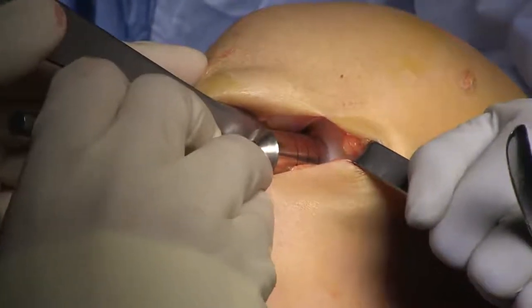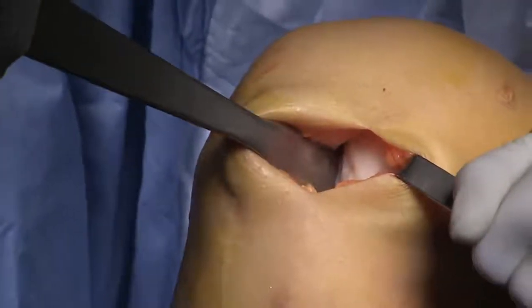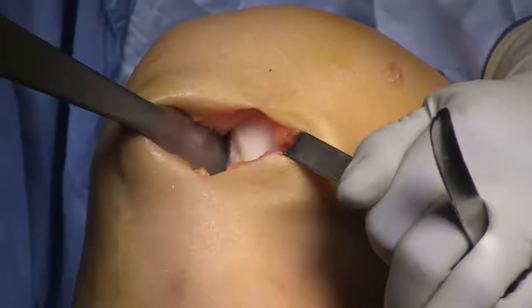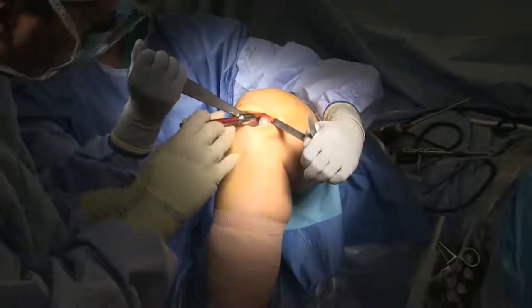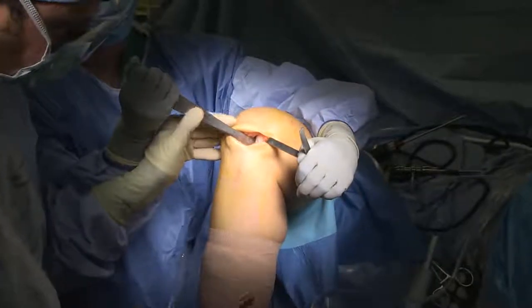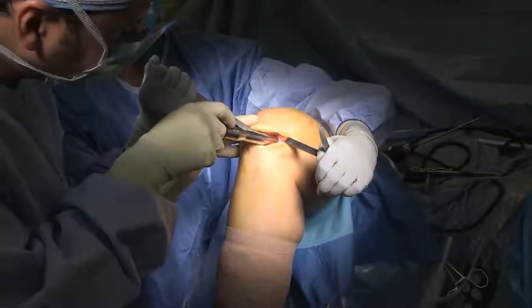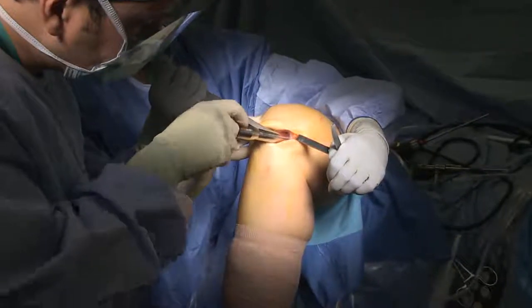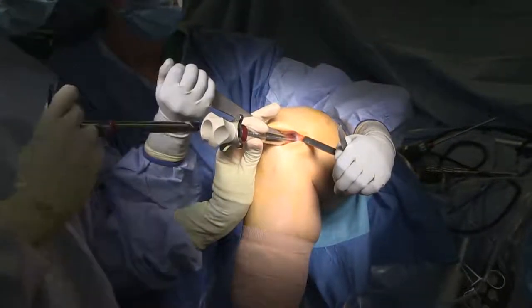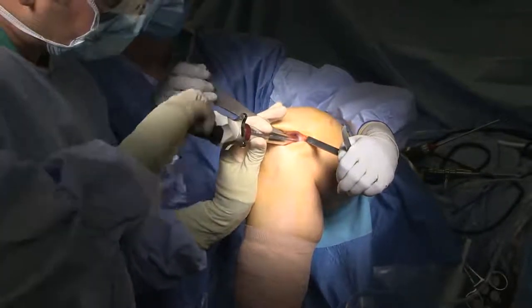I'm taking the 15 millimeter sizer up against the lesion and I like the way this fits, so we're going to use the corresponding instrumentation. I'm checking the positioning of where I want my graft to sit, then taking the coring tube over the lesion, rotating it back and forth to reach the depth of the bone. Now I'm placing the drill within the tube with the T-handle on it, rotating it 360 degrees to remove the fibrous tissue and prepare the lesion.